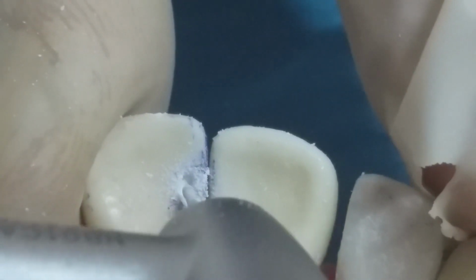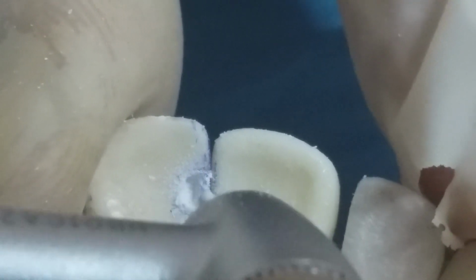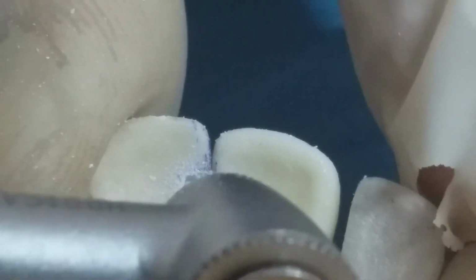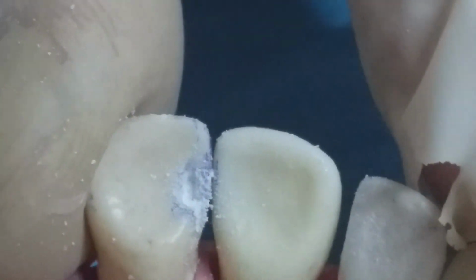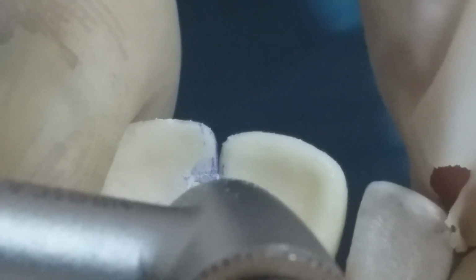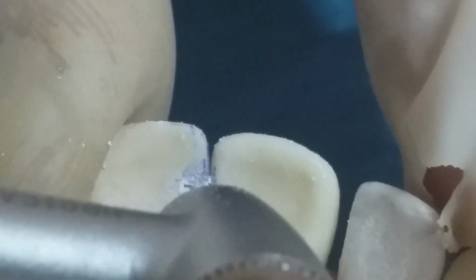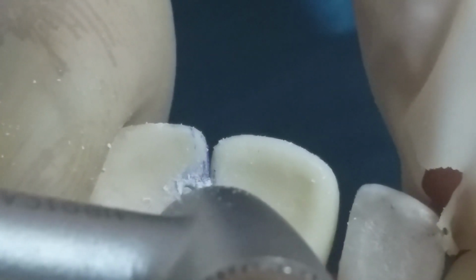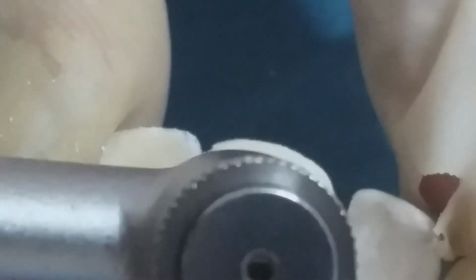Be careful during extension to preserve the tooth structure, and also when you go to the proximal contact, we will leave a shelf of tooth structure to protect the adjacent tooth from the bur. We will see this in the video when we reach this point, but now we still have to extend in this direction.